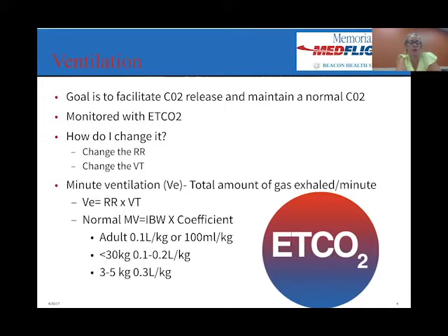You can also change the tidal volume of the patient. Normally we do it with respiratory rate first, but for some reason, let's say you're using high tidal volumes, you can also lower your tidal volumes or raise them, whatever you're needing to do. And it's the same theory. If you use a higher tidal volume, you're going to get lower end-tidal CO2s. And if you use a lower tidal volume, you're going to get higher end-tidal CO2s.